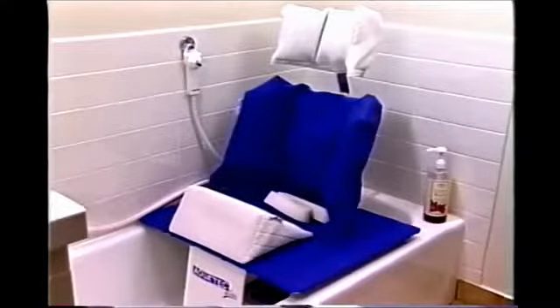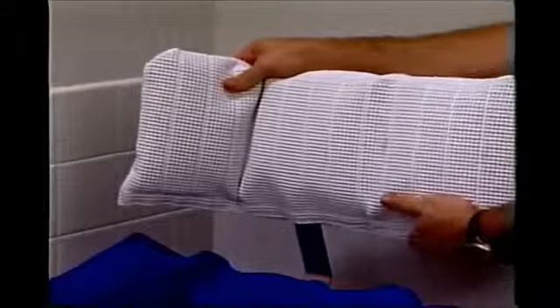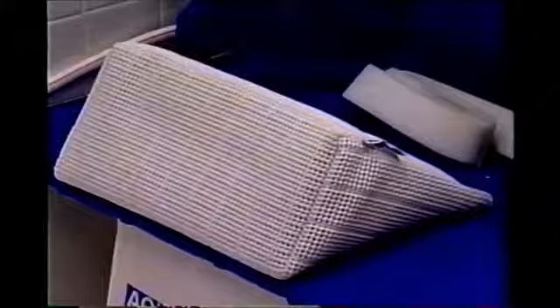The straight back recliner can also be used by individuals desiring a more comfortable recline position. A truly unique feature is that all back supports are removable to allow you to lay back and enjoy a full bath. A fully adjustable head support with side flaps can be added to any back support. Wedge-shaped cushions complete the tilt-in-space positioning.